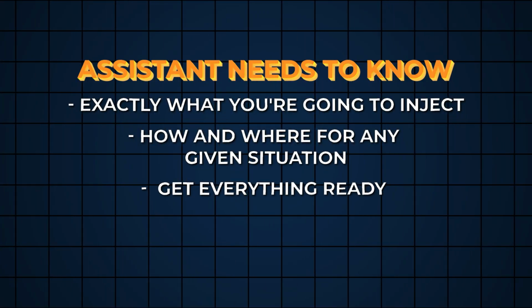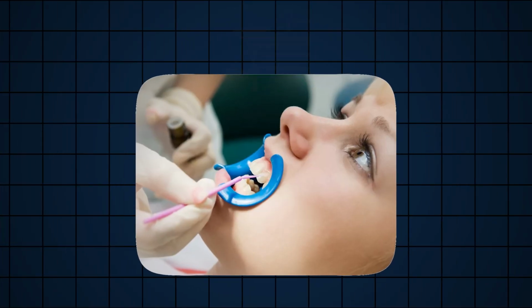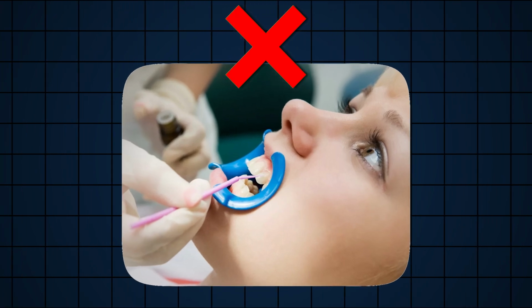The next thing is I want the assistant to get everything ready and put the topical in the mouth. The moment that topical is in the mouth, the assistant can find the doctor and tell them they're ready. Some doctors don't use topical, and I think it's more of a patient experience show thing than actually being super helpful, but it does make somewhat of a difference. You can get into the super high strength topical, but I'm not sure that juice is worth the squeeze.